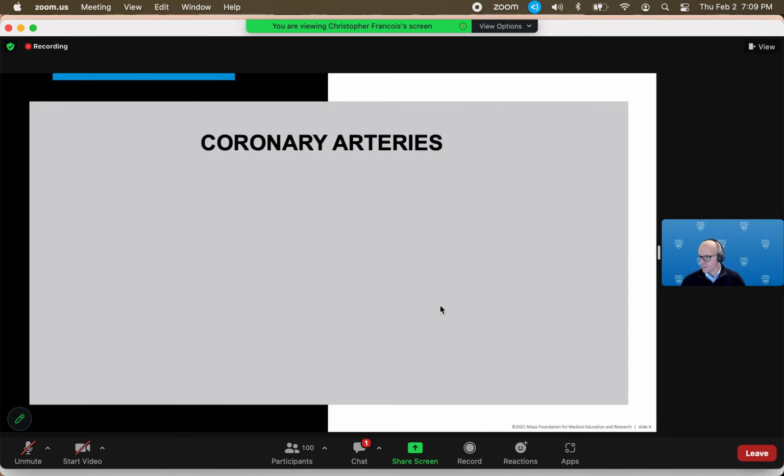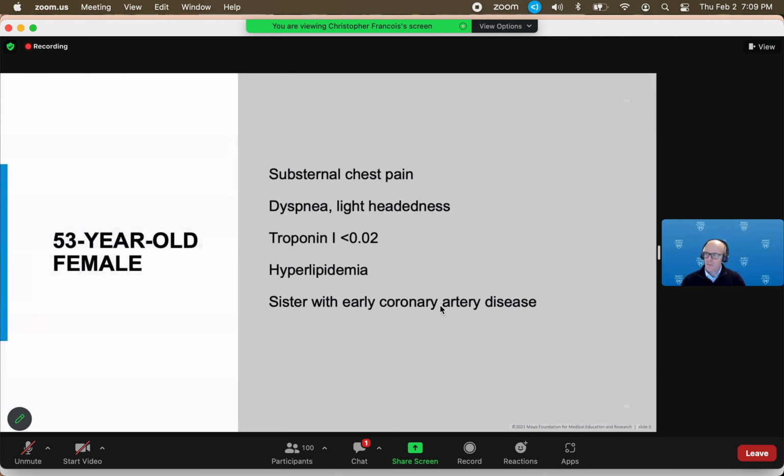And so our first test taker I see is Ahmed. And so Ahmed, you are up. And the cases on your tests, they frequently will include some basic demographic information. And so I'll give you a moment or two to take a look at that here.